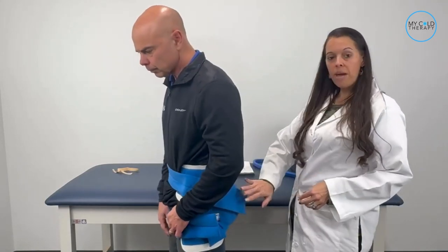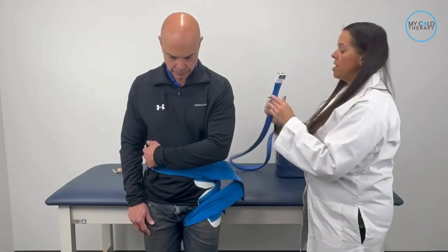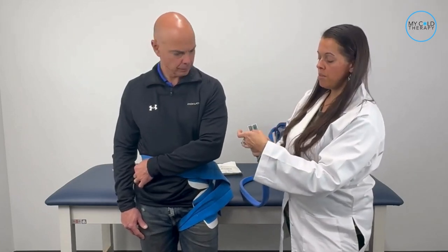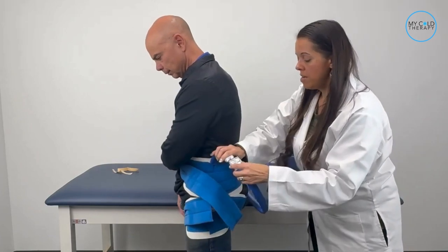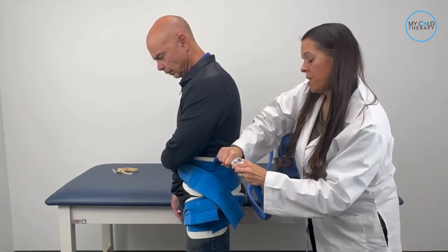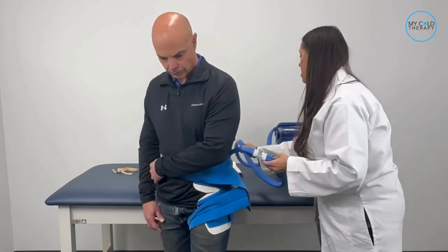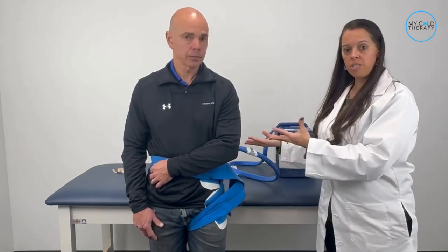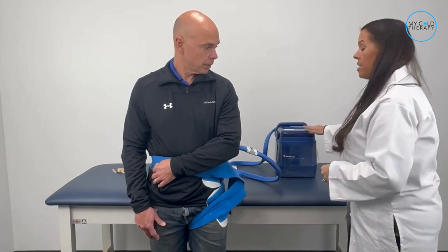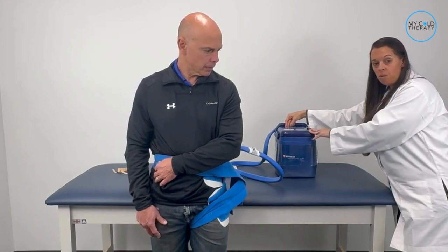Once you have the pad securely in place, you're ready to get your cooler. Take the hose from the cooler, and before you hook them together, push down the two metal tabs. Then hook the hose from the pad to the hose from the cooler — when you hear that click, that means it's securely in place. Allow the patient to get comfortable in a chair or on the bed, then take your power supply, plug it into the back of the lid on the cooler, plug it into the wall, and you're ready to go.